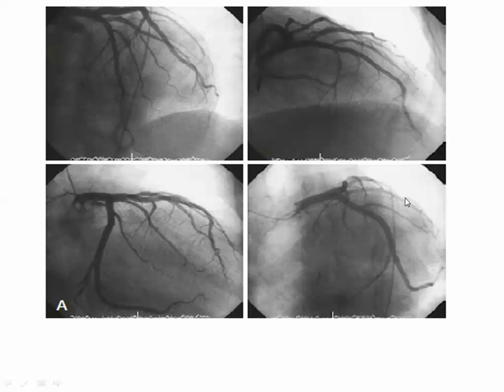This is the shaft. So there will be the spine, the diaphragm, the spine, the aorta, the shaft. Okay, so this is LAO, cranial or caudal? Caudal because there is no diaphragm. So the walls: septum, anterior, lateral, inferior. This is the left main bifurcating into the LCX and what? LAD. Yes, this is LAO caudal. Can you see the LAD? It's just the ostium of the LAD and the bifurcation.